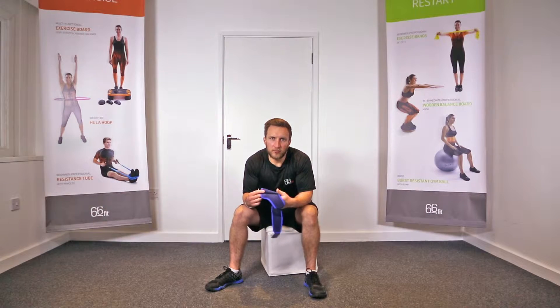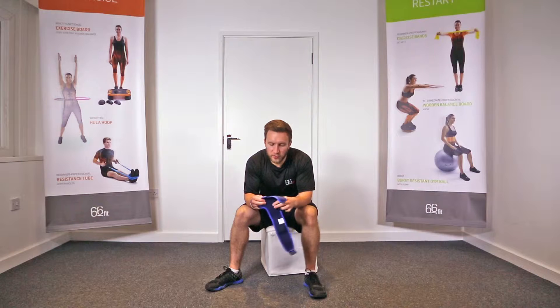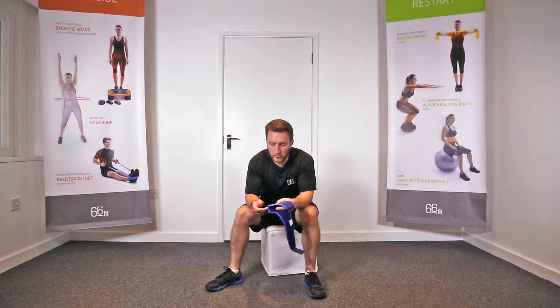This is the 66 Fit Elite Thumb Brace. It's a one-size-fits-all product designed to work with either the left or the right hand. Putting this on is super simple and straightforward — I'll show you a quick tip on how to do that a little bit easier.